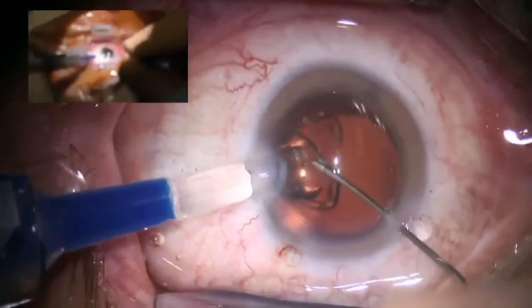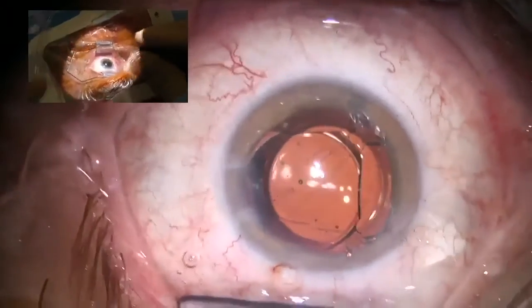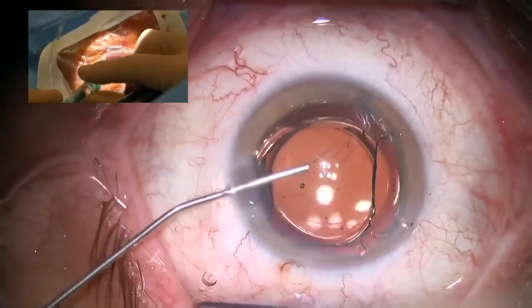Stabilize your eye, help the lens to unfold. It doesn't matter where the haptics are at this moment.